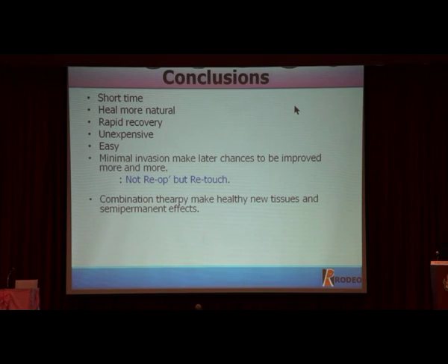Doing HIFU at the same time makes the complication of hematoma, because HIFU causes thermal damage. Thermal damage makes the circulation very active and produces growth factor. Growth factor makes a bleeding tendency. It's not recommended, but thread first, then 2 weeks later HIFU is recommended.